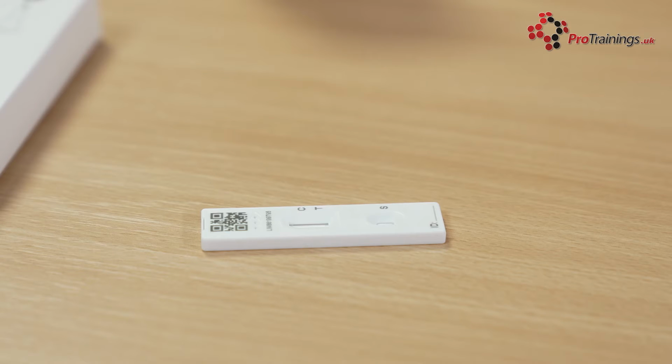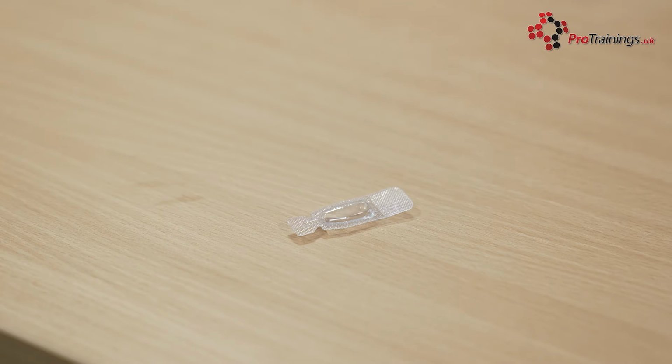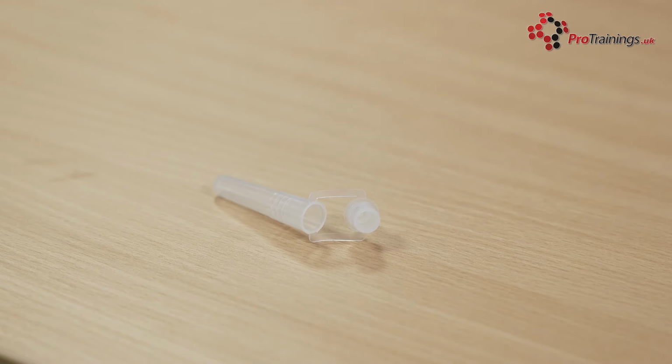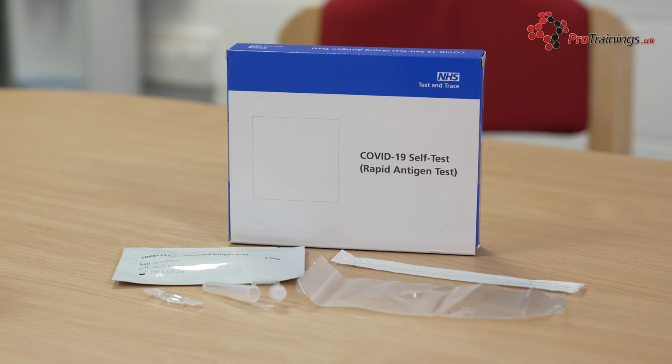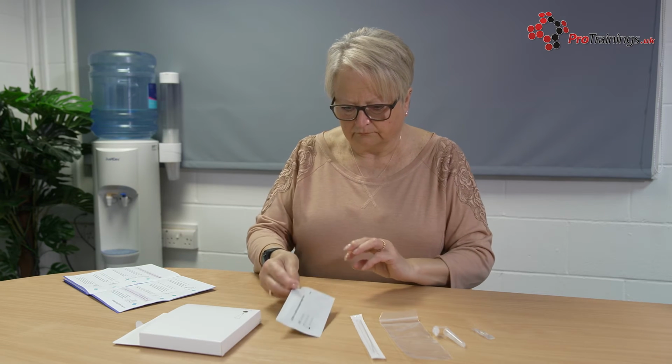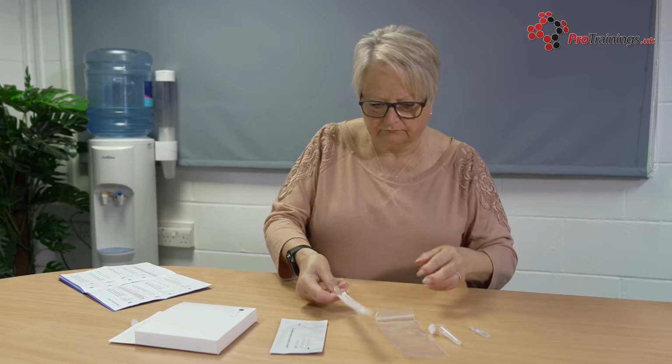Check the contents of the kit. The kit contains a test strip, swab inside a sealed wrapper, extraction buffer sachet, extraction tube holder, and a plastic waste bag. The kit we're using is the UK NHS kit, which is available free in some regions. Check all the items to make sure the packaging is not damaged. If it is damaged, do not use it.